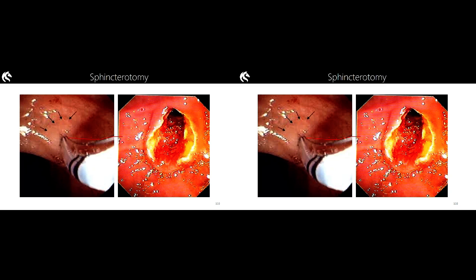I don't know whether that's a ligamentous structure or an artery. I don't know my anatomy well enough for that. So they will cut as far as they can. They can only really cut in the direction that the wire is sitting relative to the catheter, so they've only really got one cutting plane. So that is a sphincterotomy, cutting the hole bigger to let a stone out. Zach?